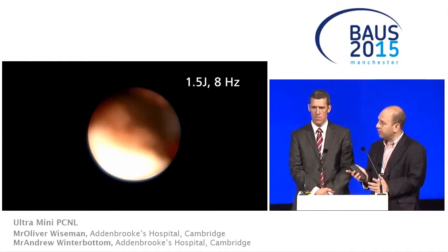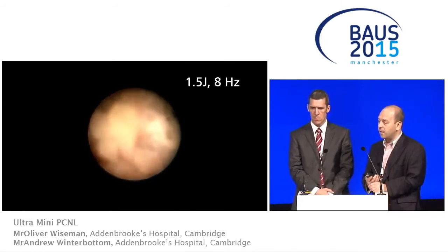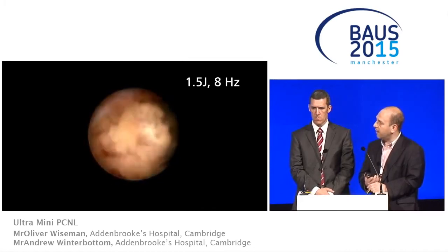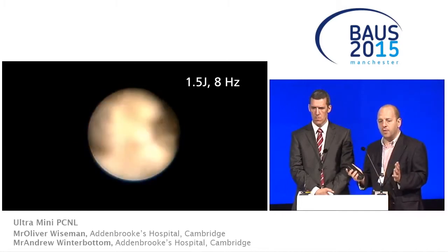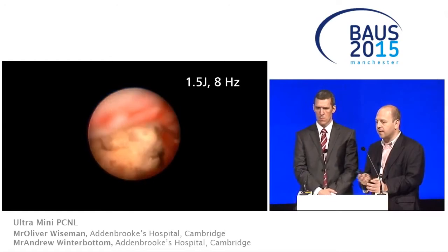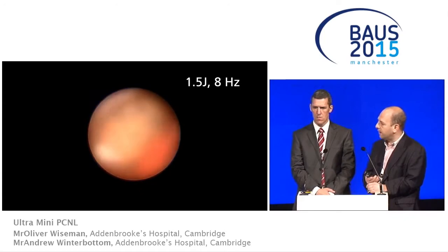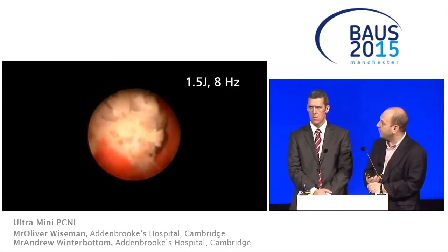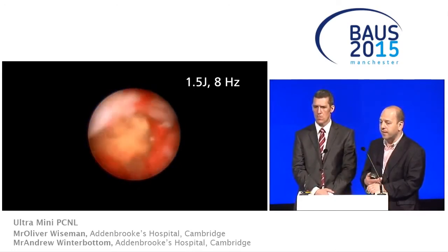Now, one of the concerns which I had, this was actually our first case of Ultra Mini PCNL. We had Janak Desai, who was the founder of the procedure, who came over from India, and we had a workshop where we did a couple of cases. I didn't really know with such a small sheath what the bleeding would be like, and I was concerned that you get into the collecting system and your vision would be significantly affected, and you wouldn't really be able to see very well at all. But in fact, my fears weren't proved to be true at all, because you can see you've got a very nice view of that stone there.